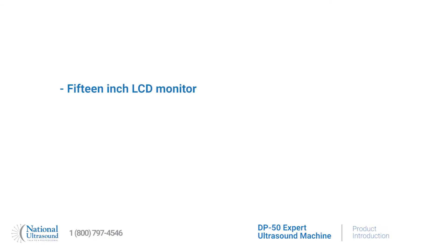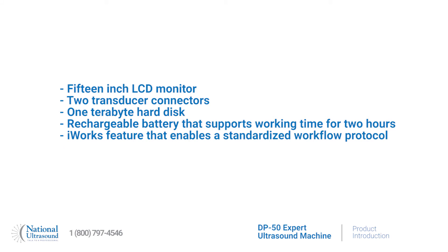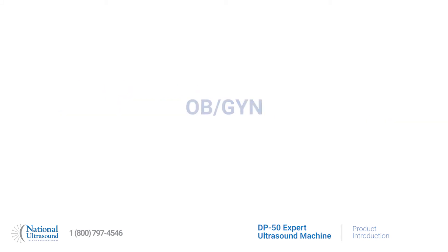Its compact design includes a 15 inch LCD monitor, two transducer connectors, one terabyte hard drive, a rechargeable battery that supports working time for two hours, and the iWorks feature that enables a standardized workflow protocol.